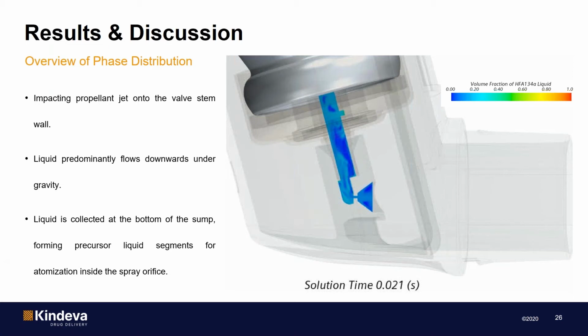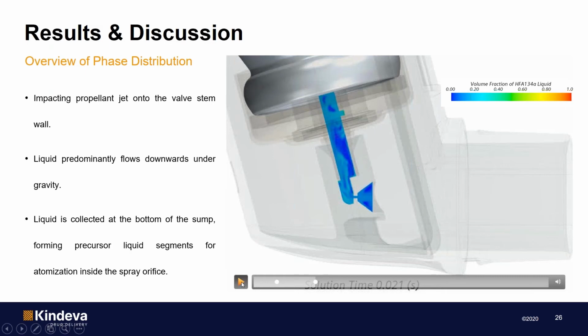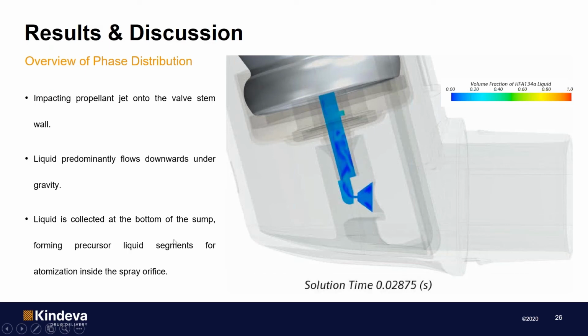And again, the force of gravity causes the liquid to drain down the walls of the expansion chamber and to make its way to the actuator sump and from there to the actuator orifice. Now, as you can see, as we are moving towards the end of this simulation, we can see the vapor-liquid mixture becomes more vapor-rich and turns into more like a homogeneous mixture.